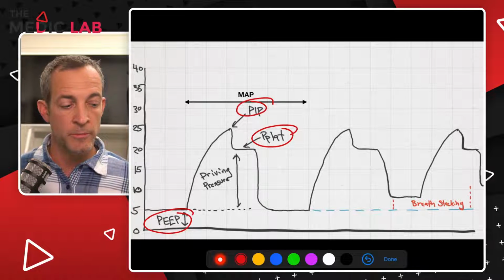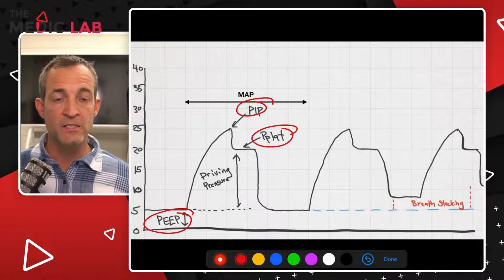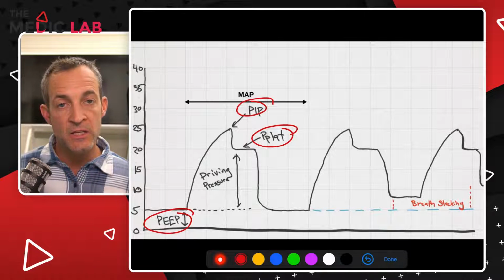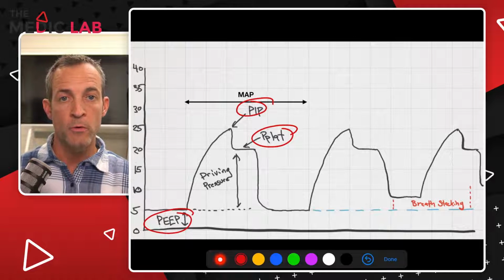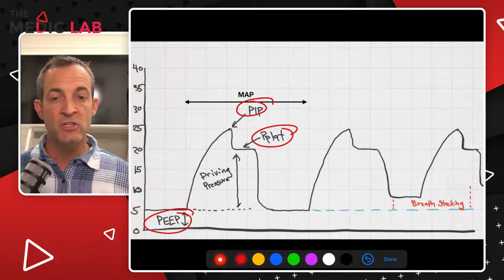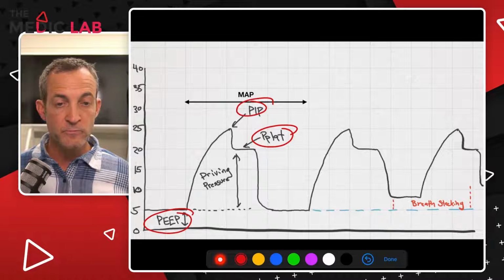When we have patients on a mechanical ventilator, we know that managing their airway pressures is important, right? In a lecture that I do in one of the classes, we talk about what is more deleterious to our patients: high peak inspiratory pressures or high volumes? The truth of the matter is, if you are giving somebody too large a volume, that will ultimately translate to higher pressures. But imagine you were simply giving somebody a breath too quickly and it was generating high peak inspiratory pressures. While that's not necessarily great for the lungs, that's not the pressure that the alveoli are seeing. So we need to break this down, right?